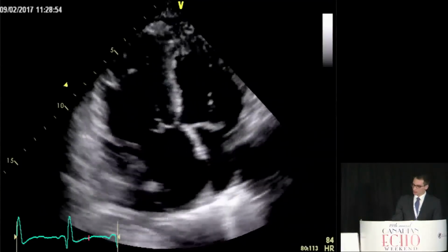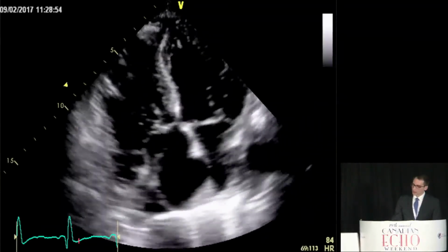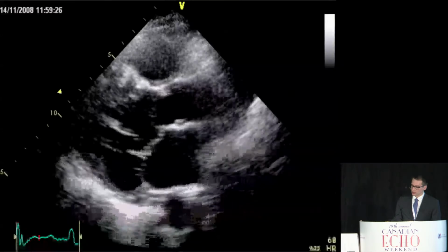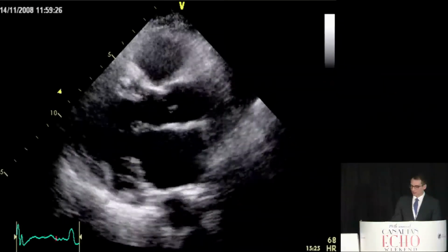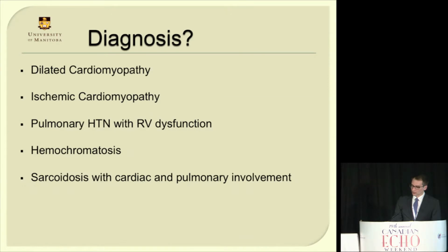And this apical four-chamber view shows dilatation and hypertrophy of the right ventricle, as well as enlargement of the right atrium and an ICD wire with thrombus attached. So before we go to a diagnosis here, I'm going to show one more image, and this is from 2008, so 9 years prior to this echo that you just saw. You can already appreciate some changes evident here. We can see that left ventricular aneurysm, which is still present then, and better motion of the left ventricle overall, however. So does anyone think this is just a mere case of dilated cardiomyopathy?